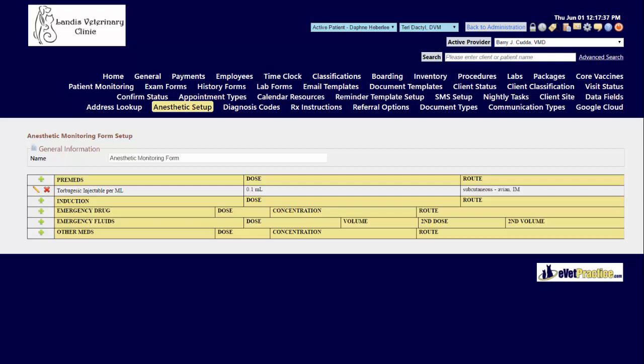You have the ability to add in your meds for pre-population for pre-meds, induction, emergency drug, emergency fluid, and the other medication section.